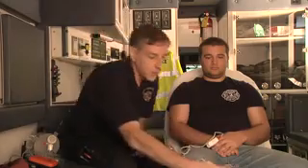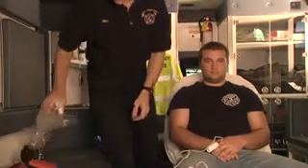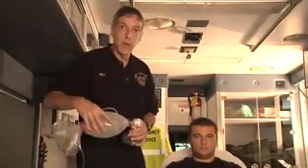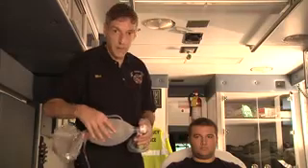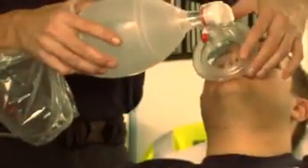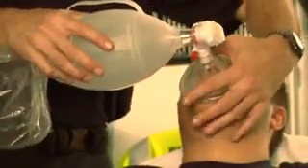So to ventilate a patient who's spontaneously breathing, we're going to take a bag valve mask connected to an oxygen source. And initially, if you don't have an oxygen source readily available, it's fine to begin ventilation with room air. And we're going to place the mask in the cleft of the patient's chin, lay the rest of the mask over the top of their face.